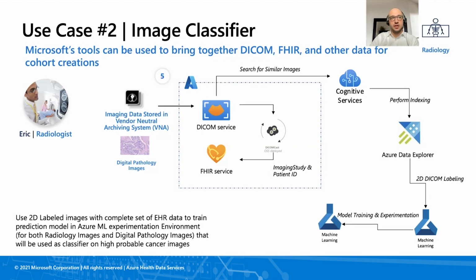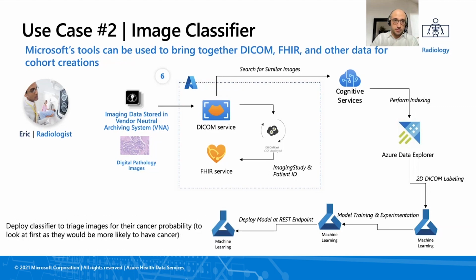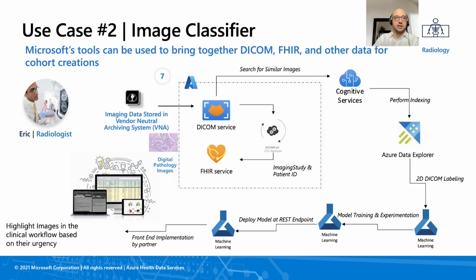Once you perform your annotations and complete your data curation, you can use the same Azure Machine Learning environment to create your model and experiment with your results. And once you are sure that your model is performing within the boundaries you set, you can deploy the model as a REST endpoint in the AML environment. And then from there, your data scientist and architect can take it and deploy it into your clinical environment.